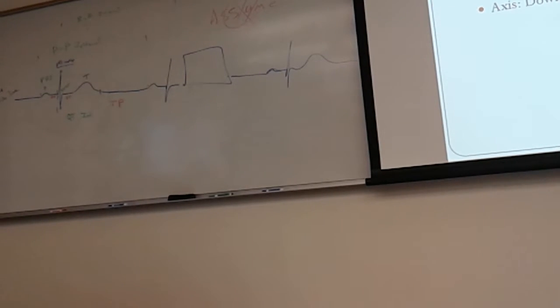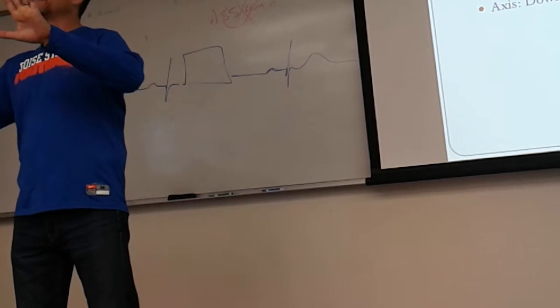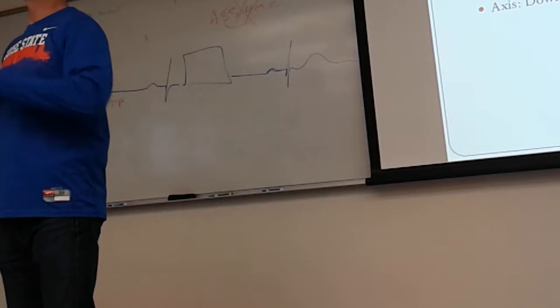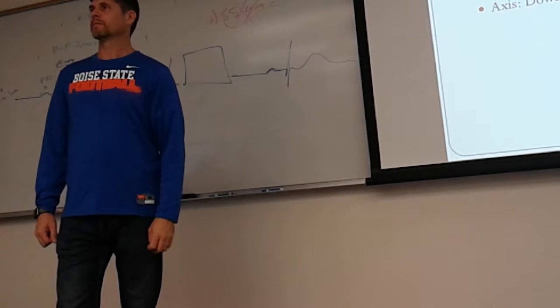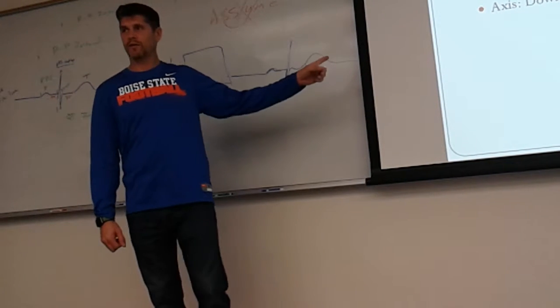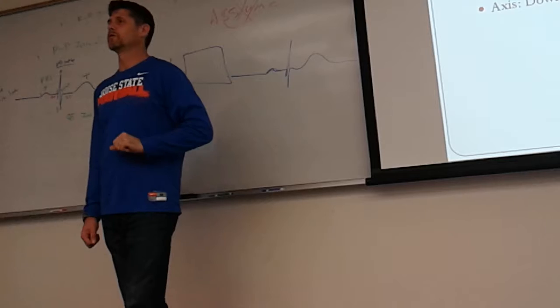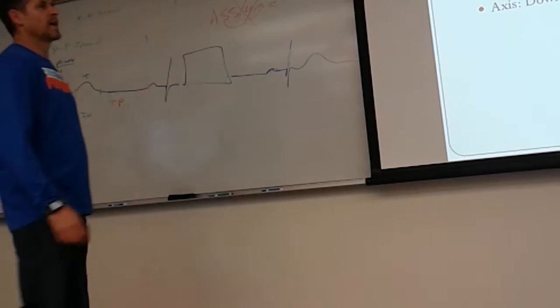Yes. Or at least you will understand, at least initially, proportion of size in one lead compared to another, based on where those cameras are. Is that going to be a whole other set of numbers memorized? Yes. Although less for the P wave and more for the other intervals and waveforms that I'm going to talk about next.